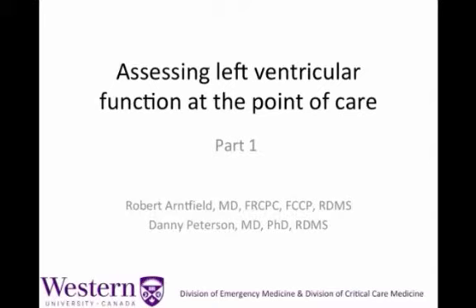This module is all about how to assess the left ventricle and its function at the point of care using point-of-care echocardiography. In particular, this initial episode focuses on the concept of the global assessment approach, the eyeball method, as well as the parasternal long axis view, how to obtain it and how to interpret it.